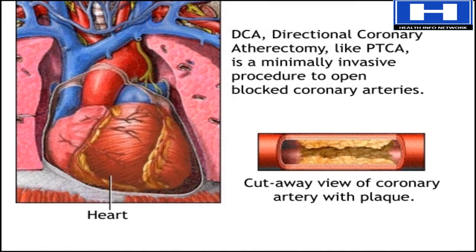DCA, or Directional Coronary Atherectomy, is a minimally invasive procedure to remove blockage from coronary arteries to improve blood flow to the heart muscle and ease pain.